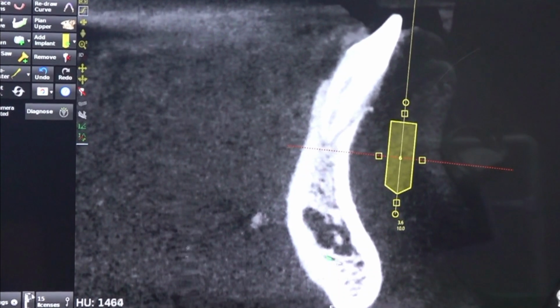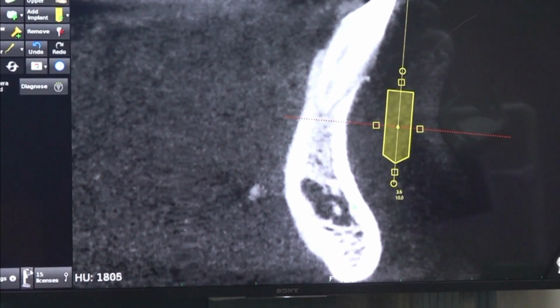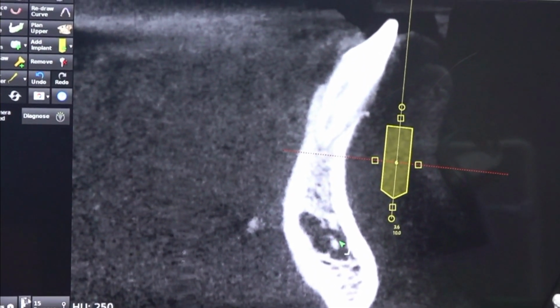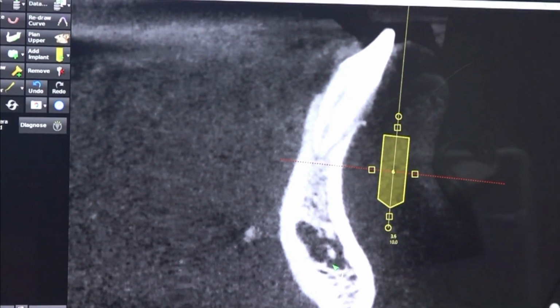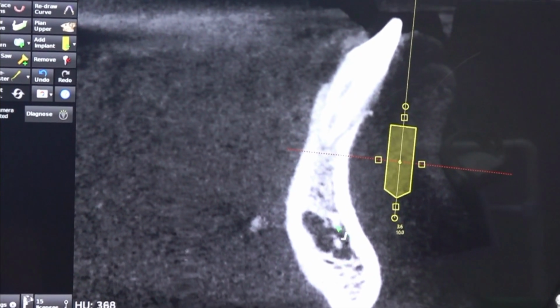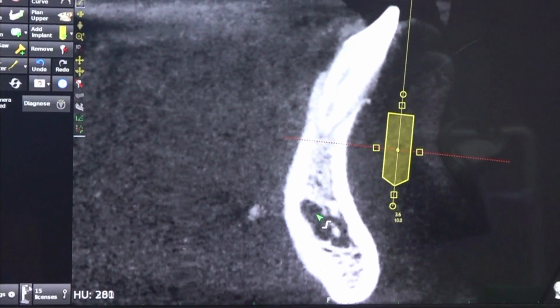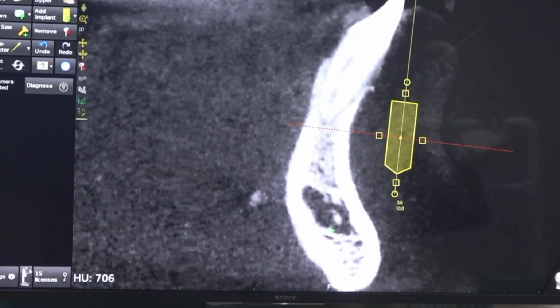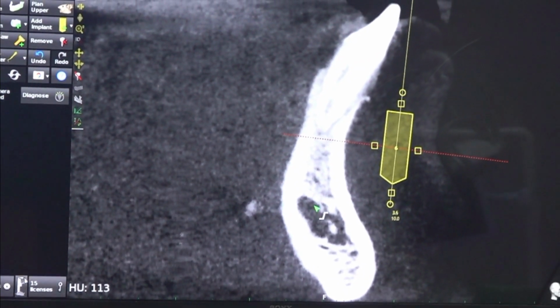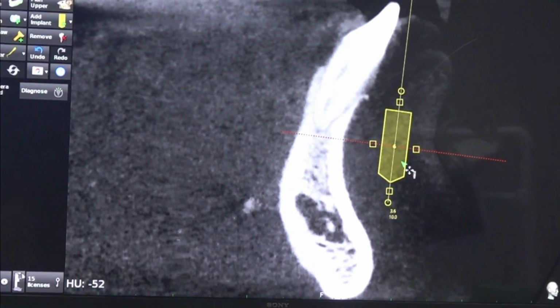So there is the intramedullary bone. This may be the intramedullary bone, or it may be the intramedullary bone with the associated mandibular incisive canal. Whenever you see this kind of intramedullary radiolucency in the anterior region, there is no advantage in going through it. What is the advantage? Your stability is not going to increase, actually it may decrease. Better keep the implant above this space.